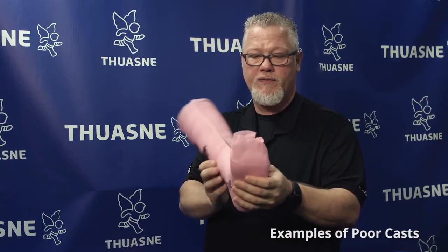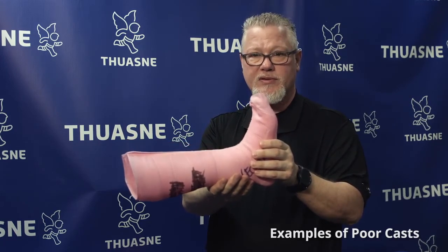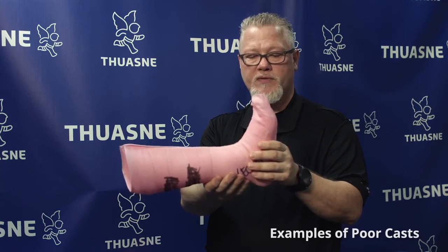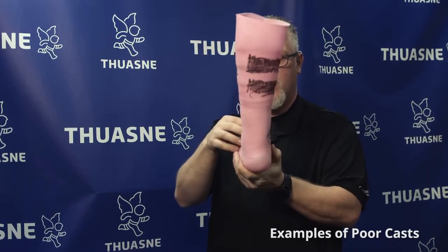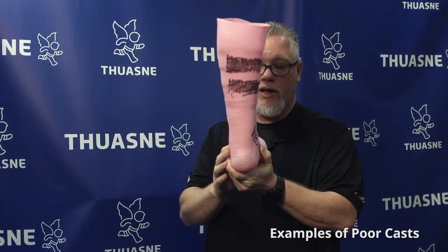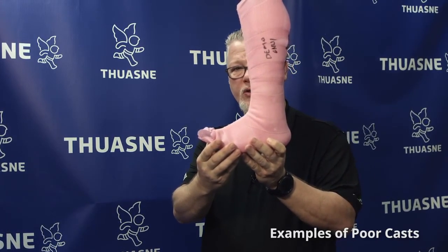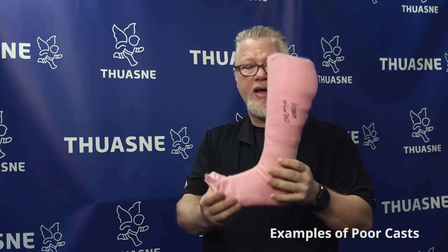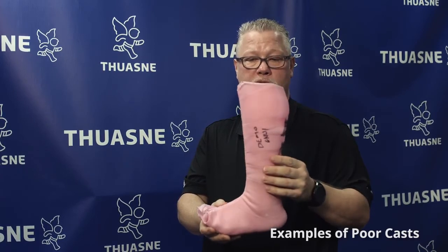So if we hold it in this direction, there's a significant amount of toe extension, which is going to present a challenge in modification. We do have the forefoot supination, but if you look there, we've now incurred a little bit of hind foot varum, so that's going to be an issue as well. And this cast is also dorsiflexed as well. So A, these casts are not symmetrical. B, in and of their own, do not match the work order, so we would have to make a phone call on this and possibly ask for a new cast.